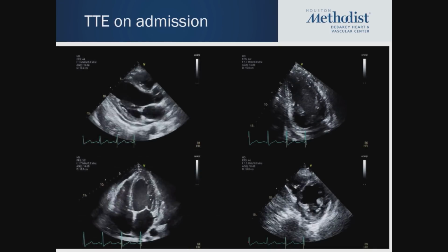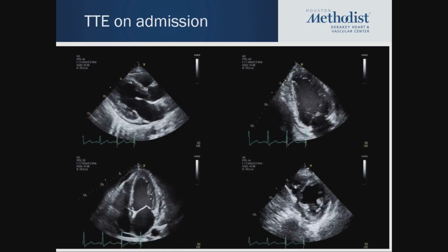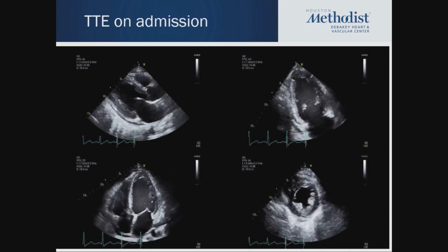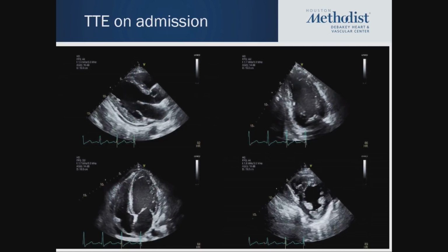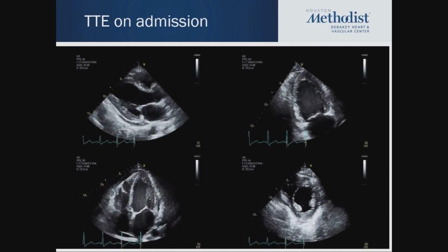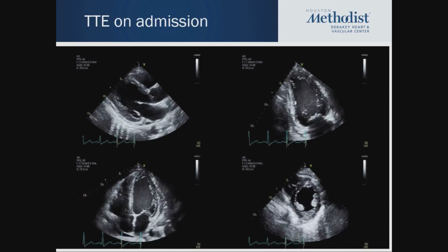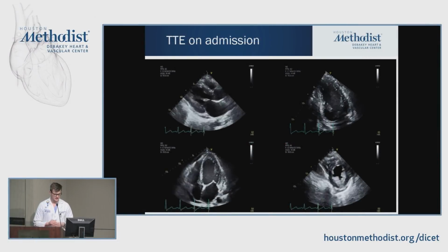And overall picture of this young man with shortness of breath, there were several reasons for him to be short of breath. First of all, he was profoundly anemic, but other than that, chest X-ray, there was a pulmonary congestion, not clear if he had a component of heart failure, plus those consolidations in many lobes were suspicious for a diffuse pneumonia. So this was the echocardiogram, which was done on the day of admission.